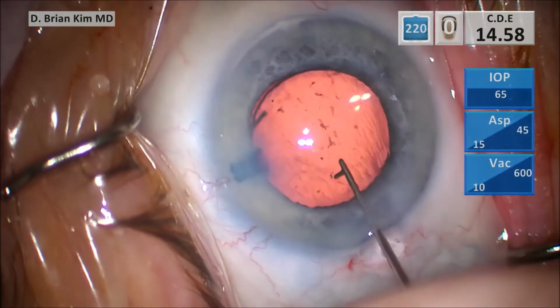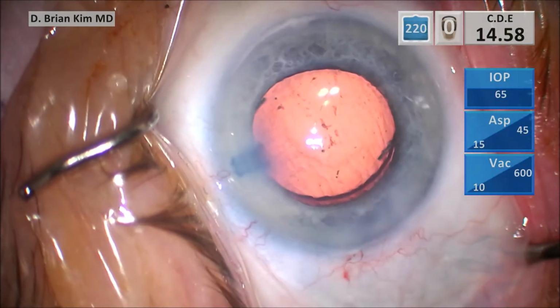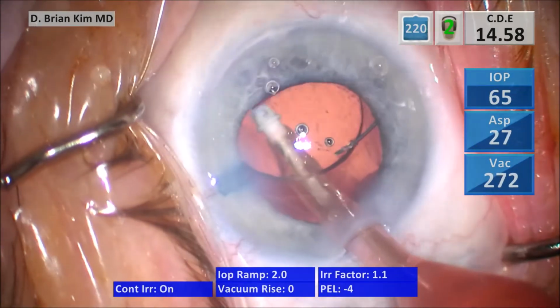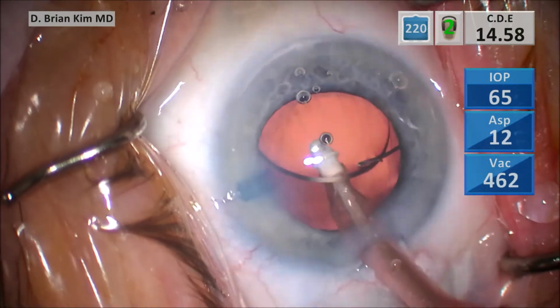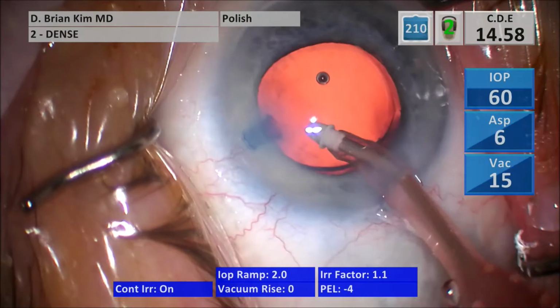Perfectly well-centered lens. These are the nice things about the 3-piece lenses. They kind of center on their own. You go in with irrigation off, activate irrigation, get underneath the lens, tilting it, removing all the viscoelastic from within the bag, polishing underneath the rhexis edge once again, making sure there's nothing stuck there.